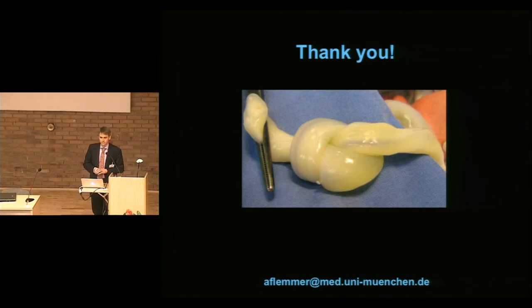In our department, we use this technique for detection of all types of air leak syndromes, and also for respiratory distress syndrome. Of course, you can use it also for detection of fluid in pleural cavities. Okay, so that's very interesting. So you should try to look at the validity of your ultrasound as compared to either transillumination and or X-ray. Yes, please.